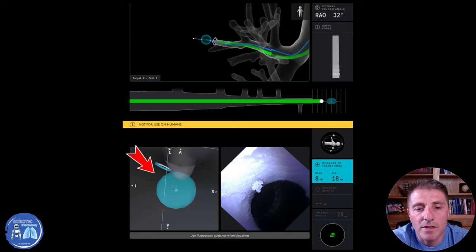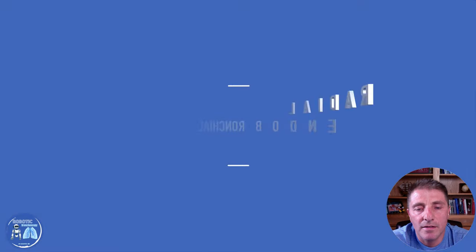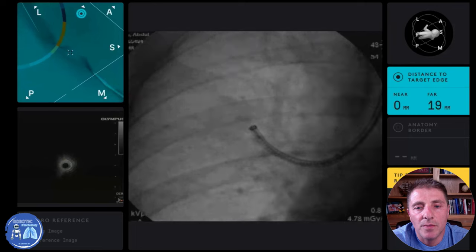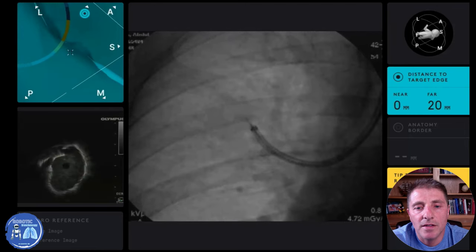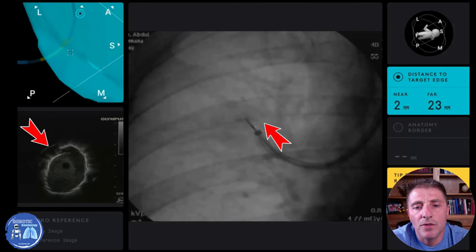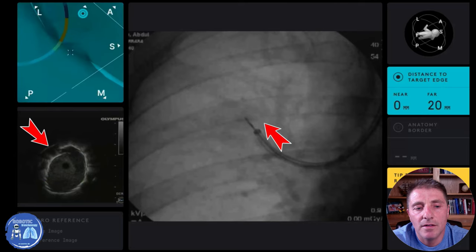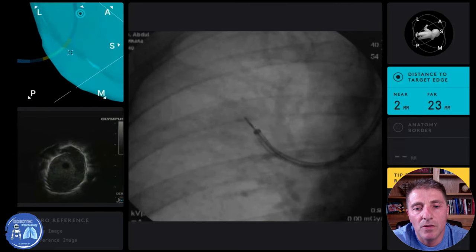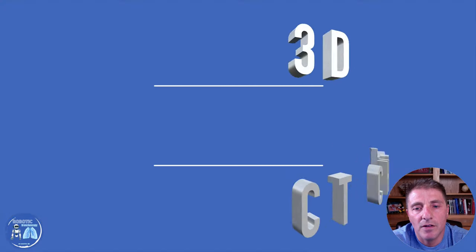When we see that we are close to the target from the driving, we move to the next step: using an ultrasound wire with an ultrasound probe, as you see, which we push through the catheter to confirm that we are close to or in the target.